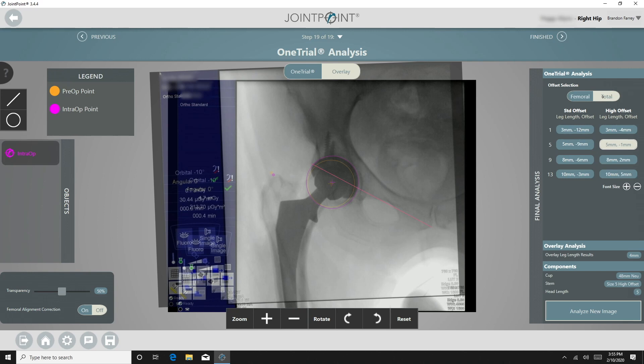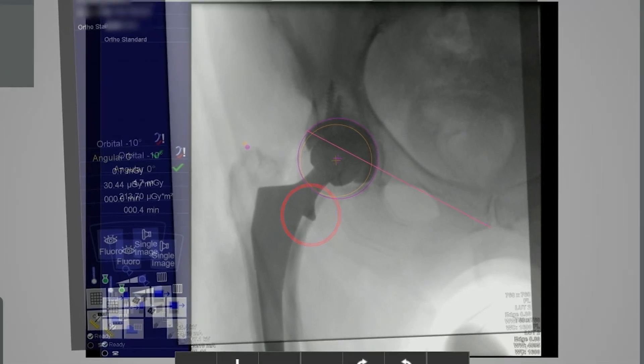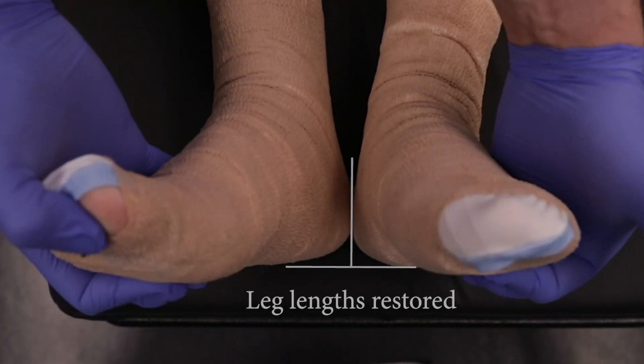In my experience, the implant tends to sit one to two millimeters more than the trial components, because of how the collar rests in the calcar. I therefore anticipate this addition when analyzing the data with the One Trial Analysis. With the final construct, the patient's leg length was five millimeters long, plus one millimeter of femoral offset and minus one millimeter of total offset, reproducing the desired anatomy as planned prior to surgery.